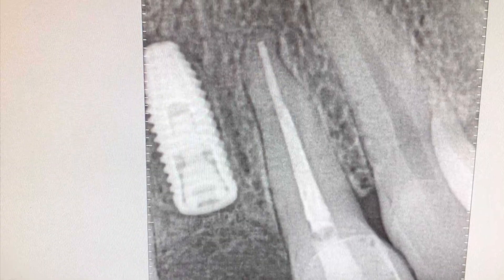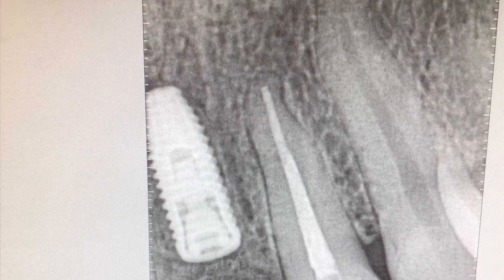Here's the position of the implant — you can see it's idealized. It's the same as when we did the planning.